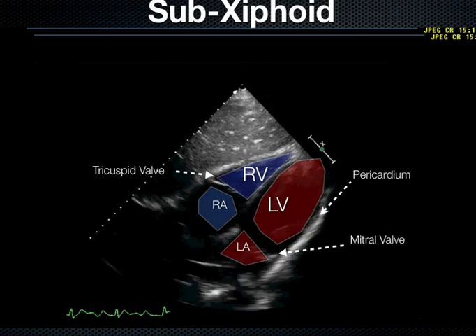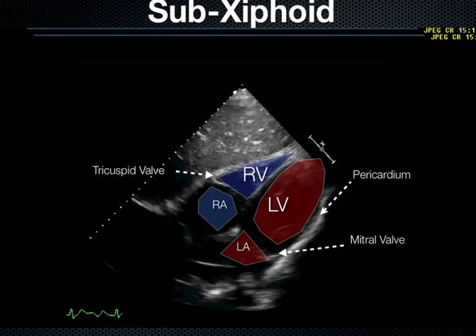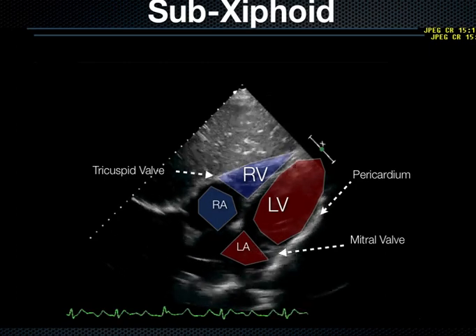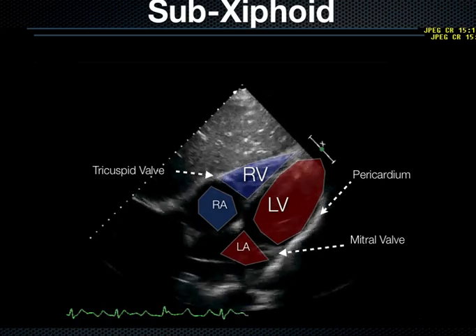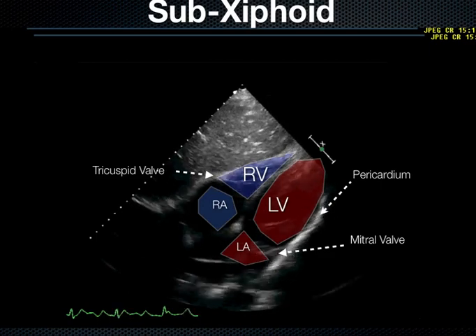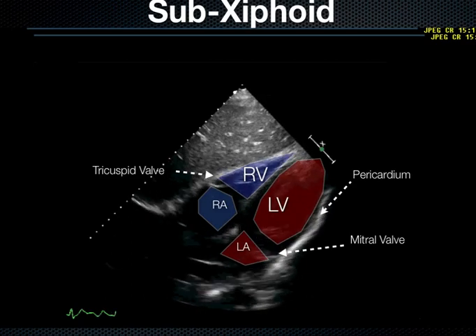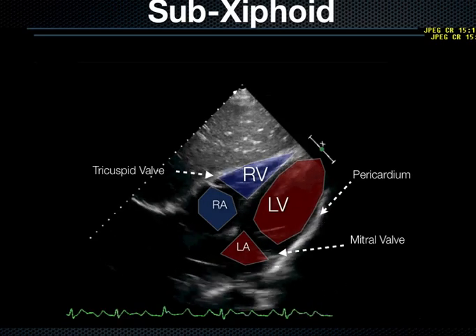Number one, I use it when a patient's dead and they're coding, they don't have a pulse, and I want to see, are they really dead or not? I want to see, is the heart actually standing still, or is the heart moving? You'd be surprised how many times somebody doesn't feel a pulse, myself included, but when I go to look at the heart, it's actually moving. So it helps you determine that more accurately when you can actually see the heart moving.